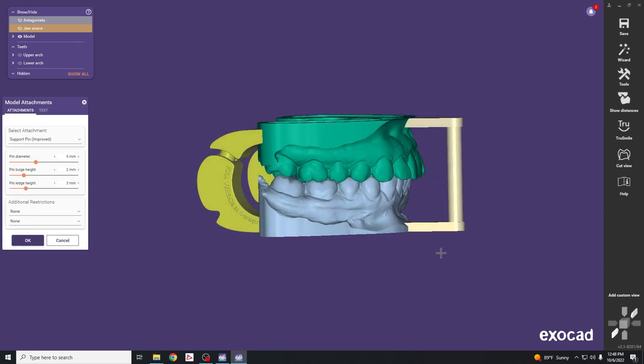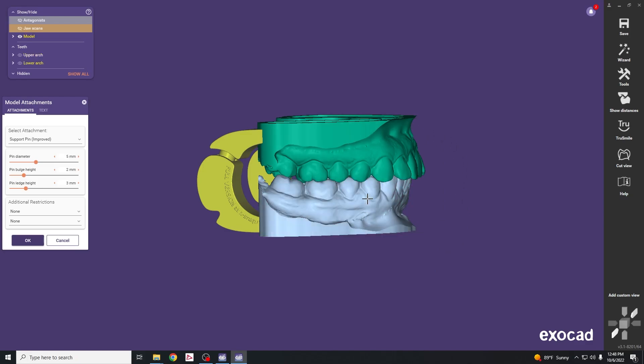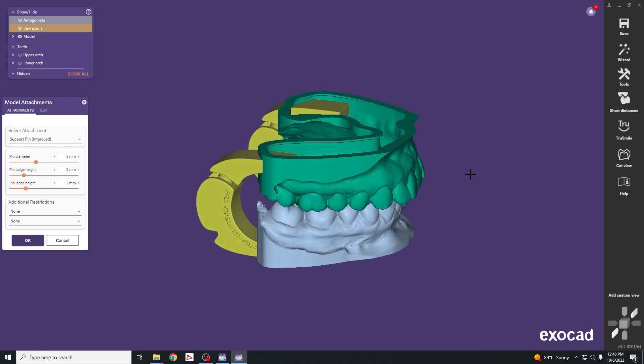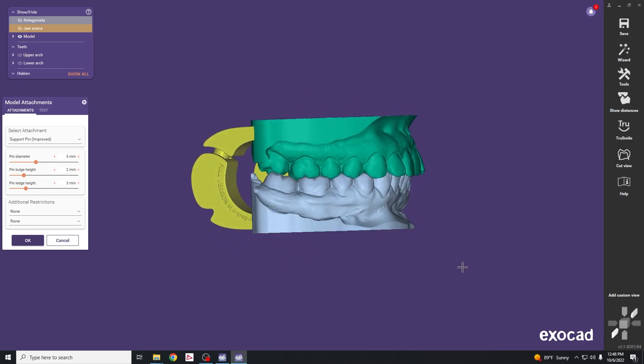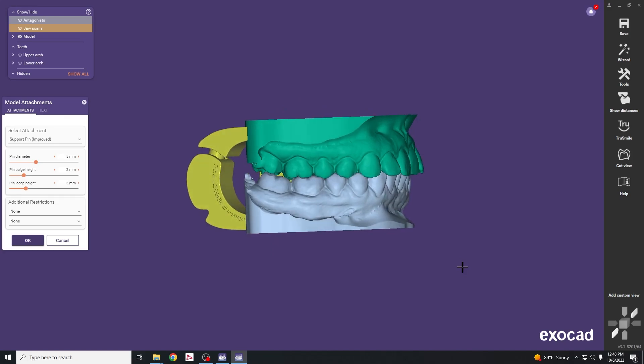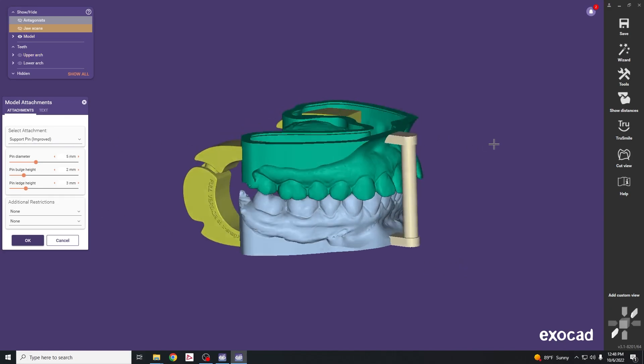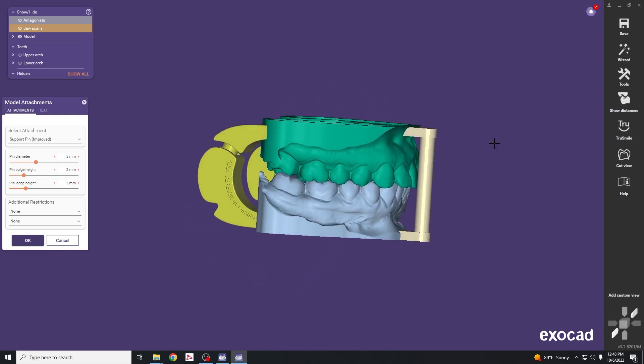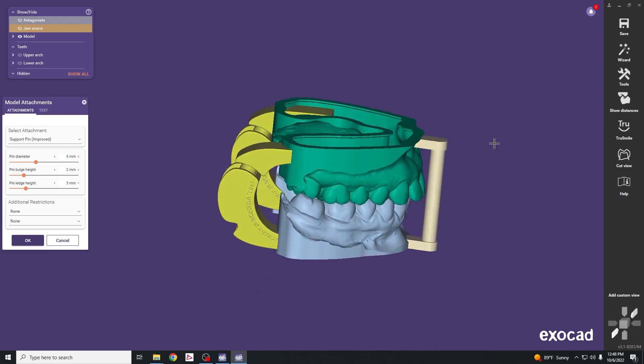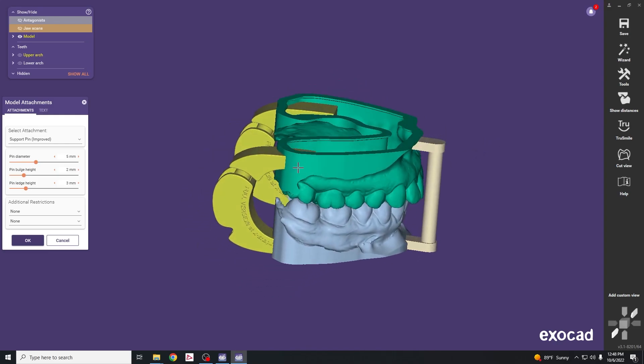Recommendations for choosing attachments: if you want to mount these on the semi adjustable articulator, you can print without any attachments and add plaster to the top platform to secure it to the mounting plates. The support pins are helpful when you're unable to tripodize and get a stable MIP record.